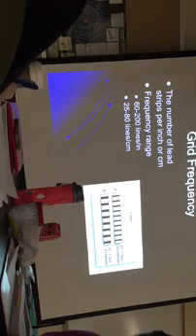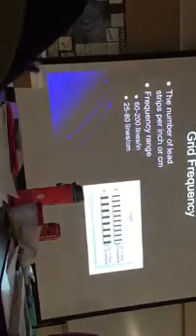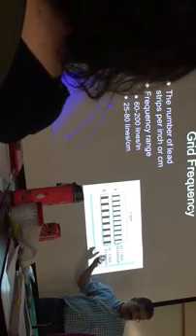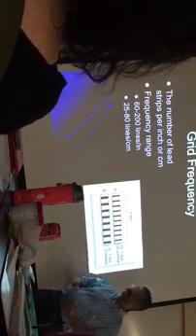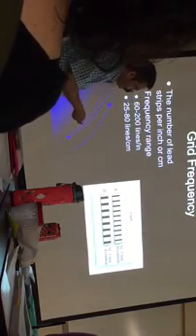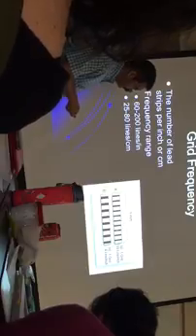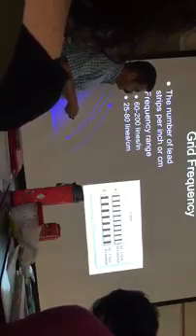Now, let me show you this. This is going to be confusing sometimes. Just because you're changing the grid frequency doesn't mean that you're changing the grid ratio. For example, here, take a look. Both grids here are 10:1 ratio grids. Both of them. 1, 2, 3, 4, 5, 6, 7, 8, 9, 10. 1, 2, 3, 4, 5, 6, 7, 8.